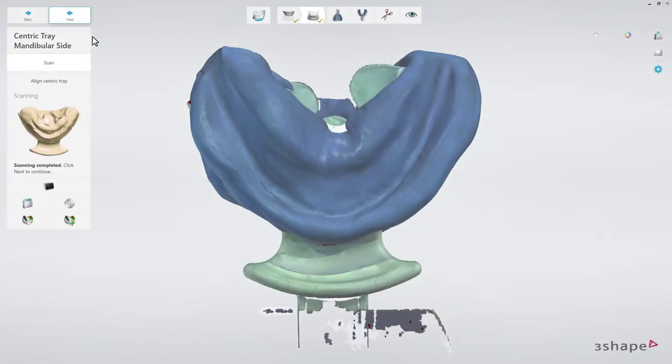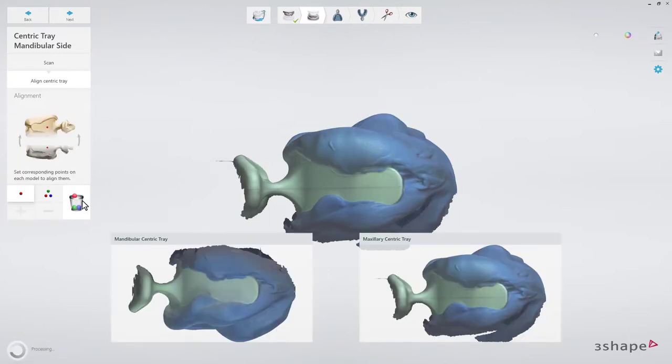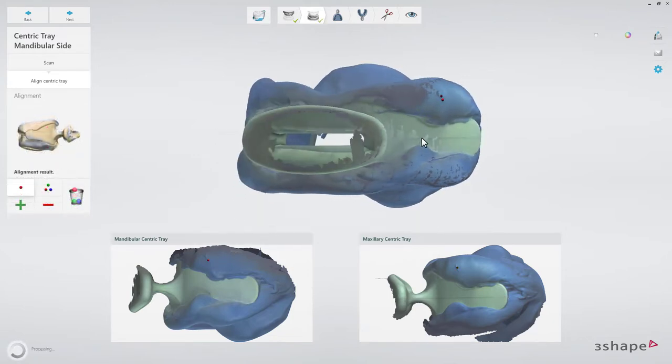Next, the alignment of the maxillary and mandibular sides of the Centric Tray will be done automatically. Use the Align Manually button to realign them manually. When finished, click Next.